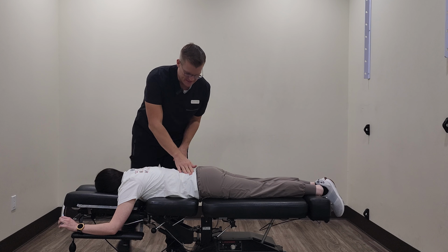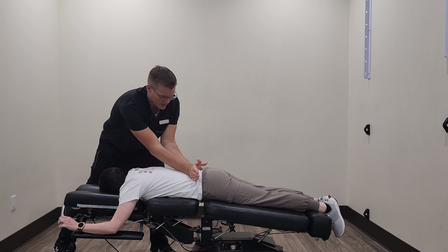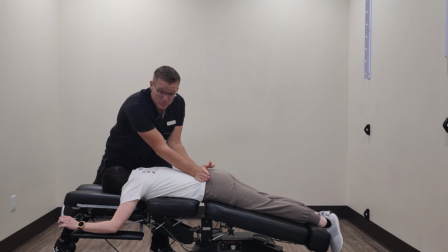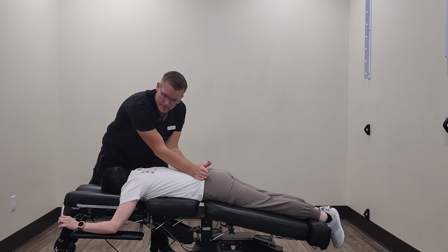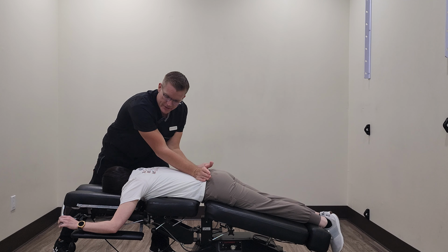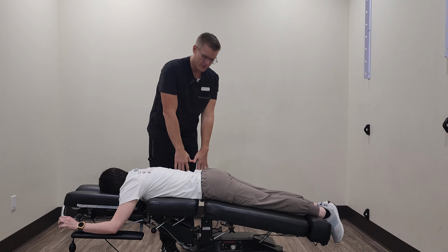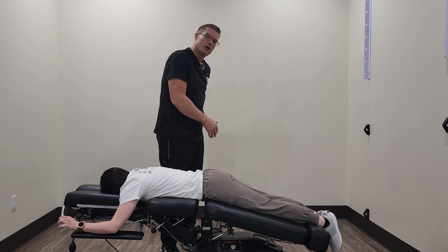So as this table goes down, we will palpate that area that we're wanting to work on. And as the table goes down, we're going to push the patient's, in her case, her L5 and her iliac crest at the top of the pelvis downward. It adds a lot more stretch just to that area. Now, most of us, when we want to stretch our low backs, this specific area is very difficult to stretch on our own. If we just try to touch our toes, most of us will feel it in our hamstrings and in our upper back.